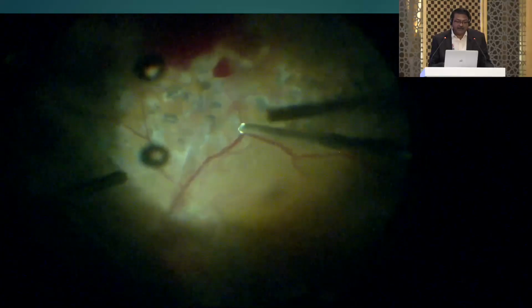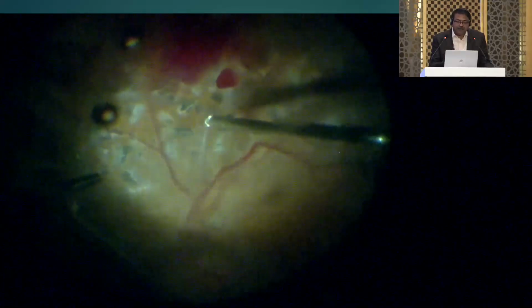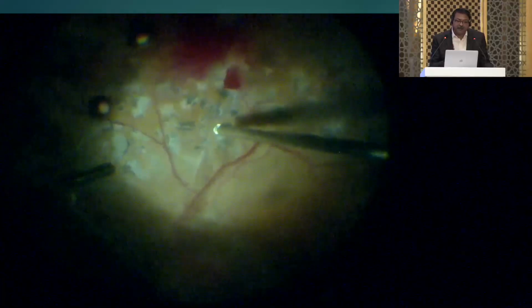Now, in diabetics, you could induce PVD in small increments. So you induce a small area of separation because there could be attachments at various points. So use the suction to elevate a bit of the vitreous, excise that, then go to the next clock hour, then excise that. So you go in incremental fashion in diabetics, not trying to do how you would do in any other patient of, let's say, ERM or a macular hole. So this is how we proceed in a patient with diabetics.